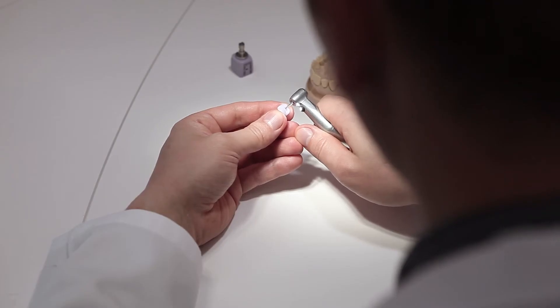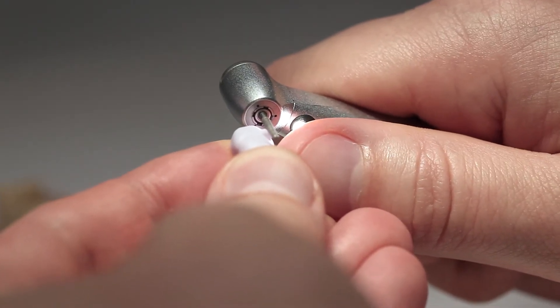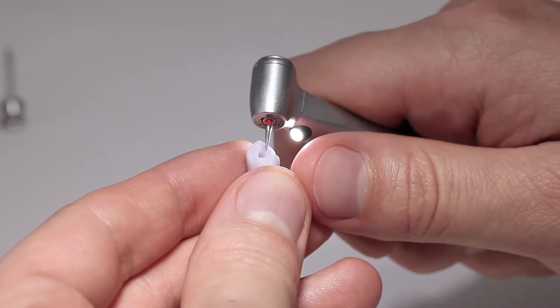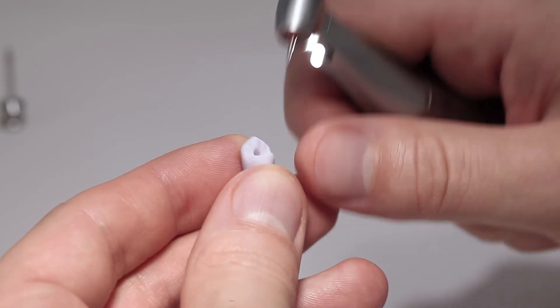Smooth out the attachment point, taking the shape of the emergence profile, crown margin, and proximal contacts into consideration. Surface grind the occlusal surface with a fine diamond to smooth out the surface structure created by the CAD/CAM procedure.